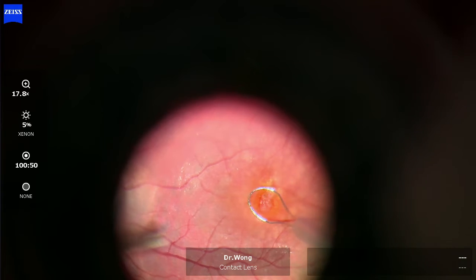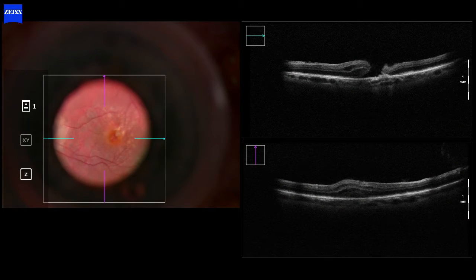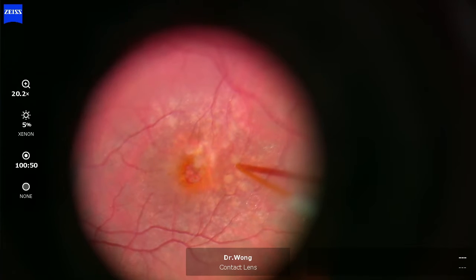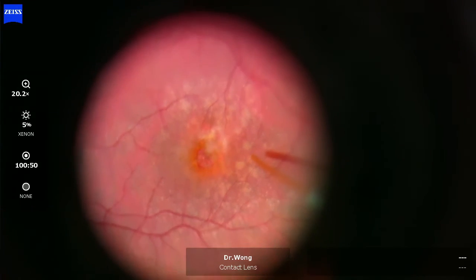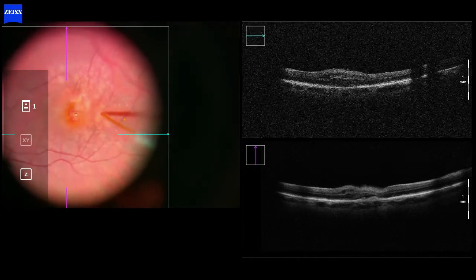After this maneuver, we use the intraoperative OCT to check the status of the edge adhesions. We can confirm there is still some tight adhesion at the temporal edge. With the use of a 38-gauge polytip cannula, we then try to induce a small localized detachment of the temporal retina in order to free the temporal adhesion.